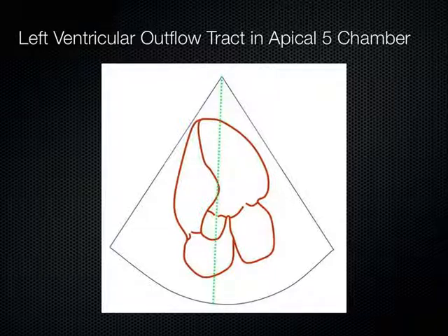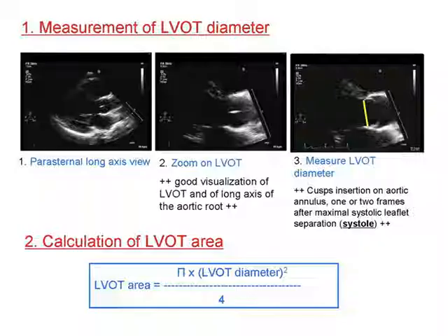Now, that left ventricular outflow tract seen in that apical 5-chamber view, this is just a schematic of it. This is where you're going to be dropping that Doppler gate right through here. And somewhere along that gate, you'll see that little TIE fighter looking thing. That's going to be right on the edge of this aortic valve, just right along here. That's where we're going to be dropping that Doppler TIE fighter, in this general vicinity. And that will set us up to measure the cardiac output. Let me show what I mean.